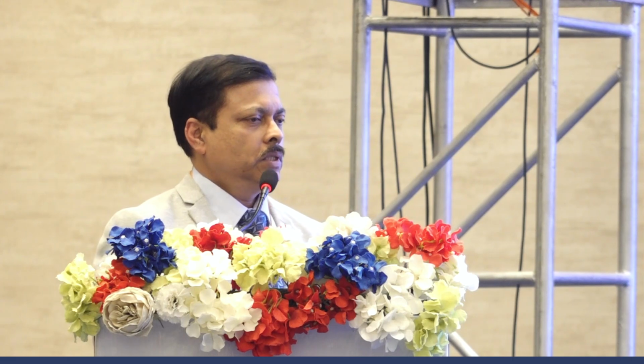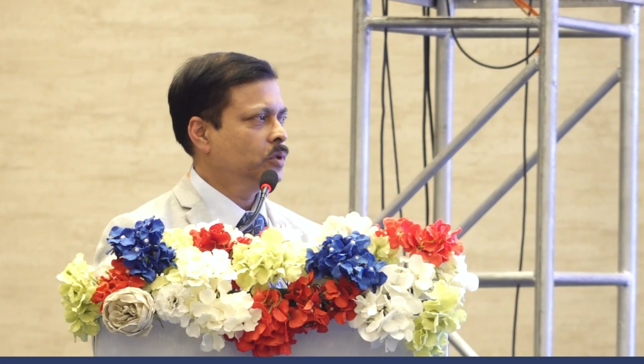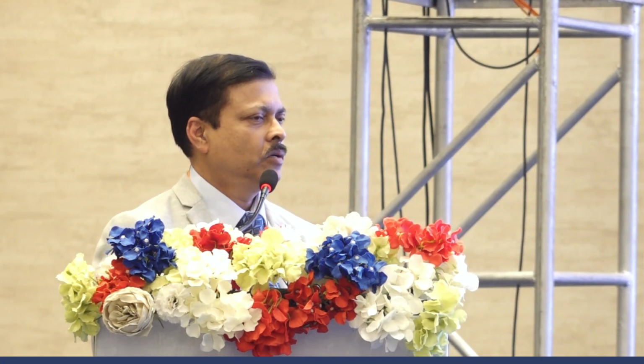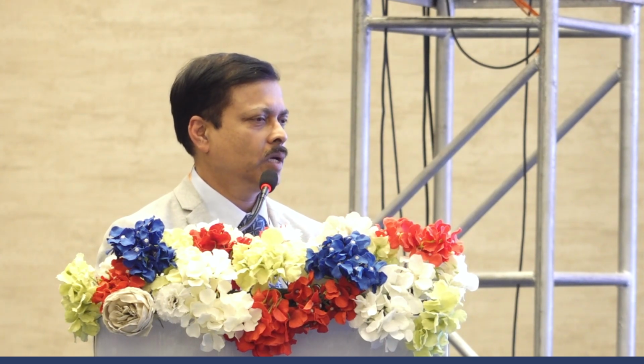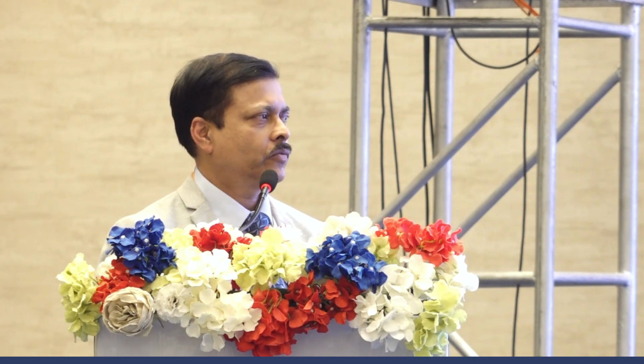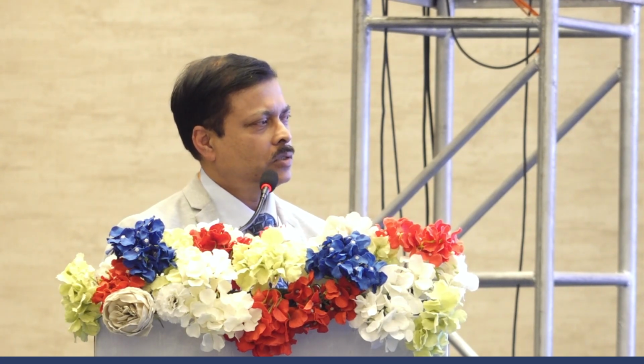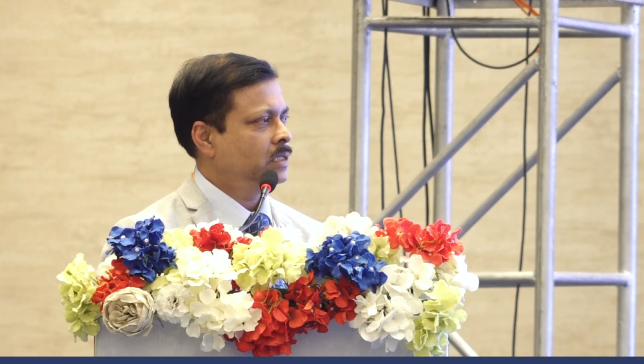So if you see, Dr. Bose, we have not done NIBUT, although all these kind of devices do NIBUT, because when we started analyzing the NIBUT attachment, what we found was that the central cornea, the central 4 or 5 millimeters of the cornea, behaves completely different from the peripheral cornea. And you also have to realize that the central cornea has the richest density of nerves. So that is the area which the body also controls very, very tightly.